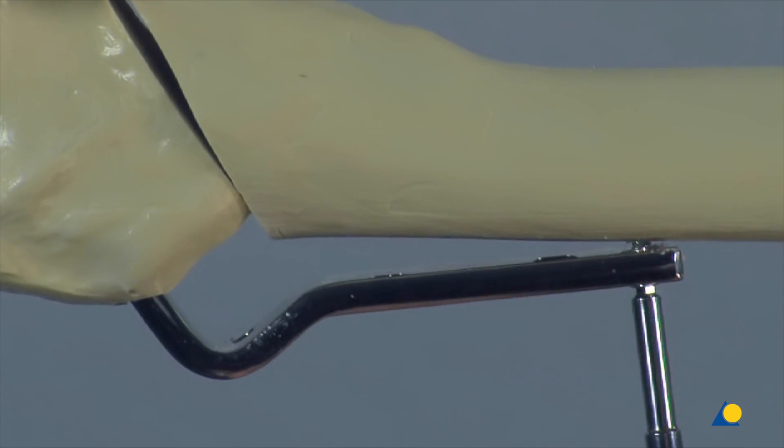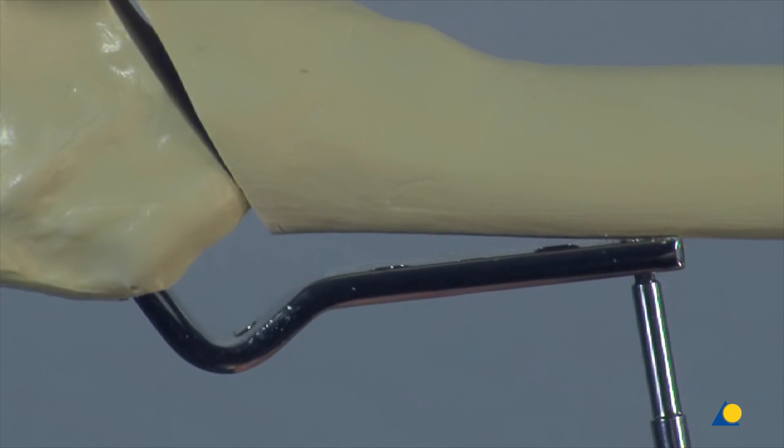A neutral 4.5 millimetre monocortical screw is inserted in the distal plate hole as a temporary measure.